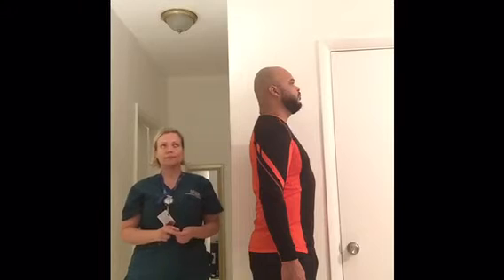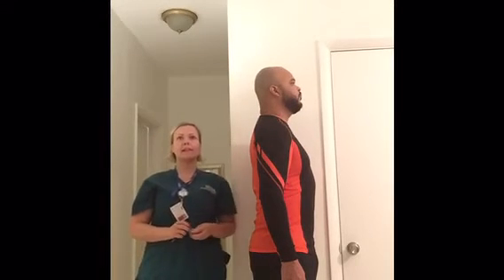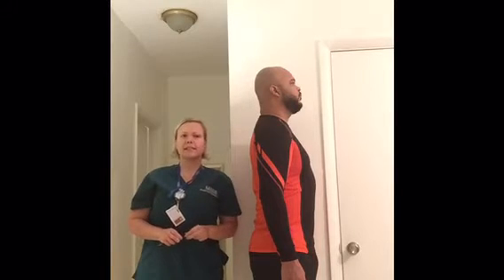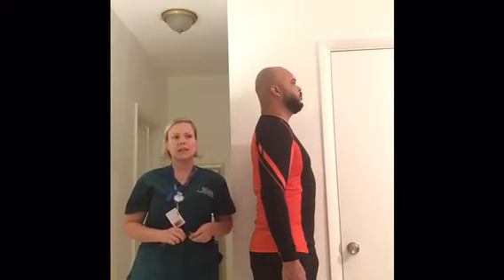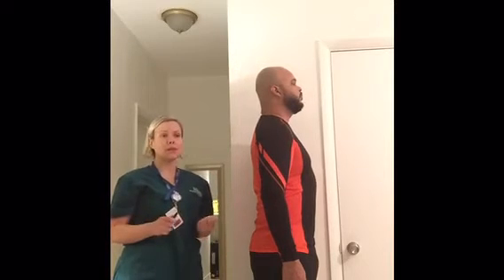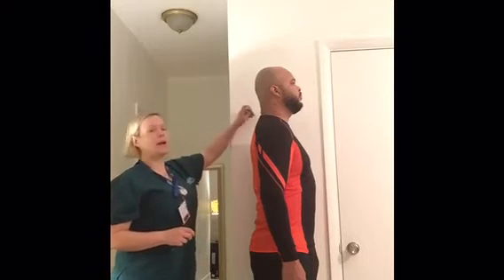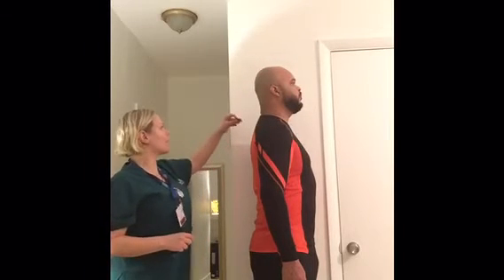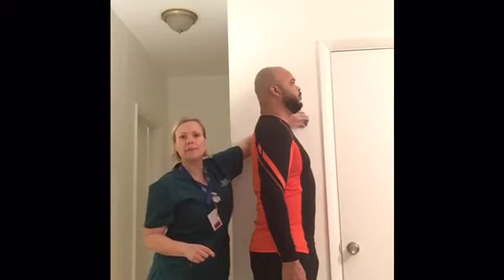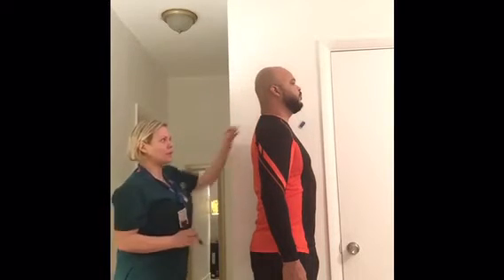The technical factors that I will use are like 65 and 14. The tube has to be perpendicular, and it will be centered to C4. I will make sure that I place my marker on the light field, and then I will expose right there.